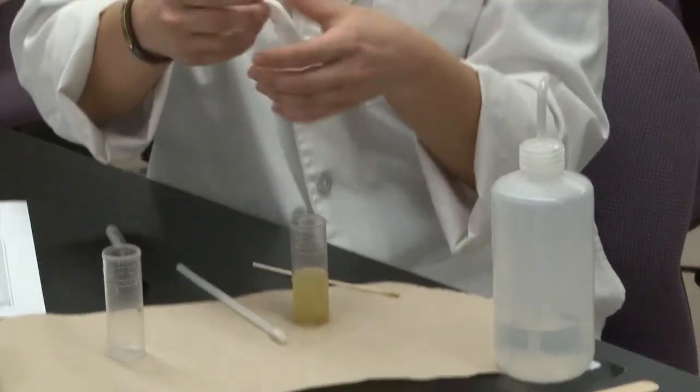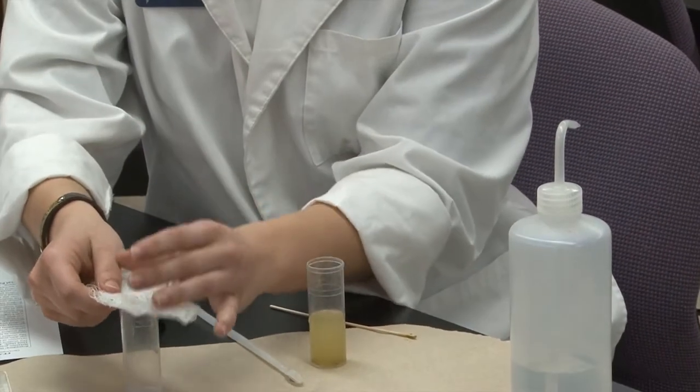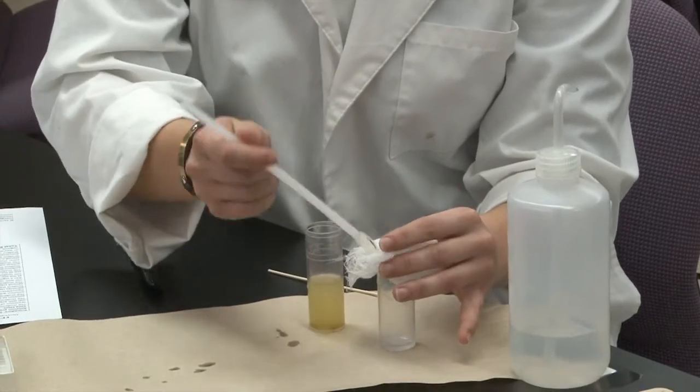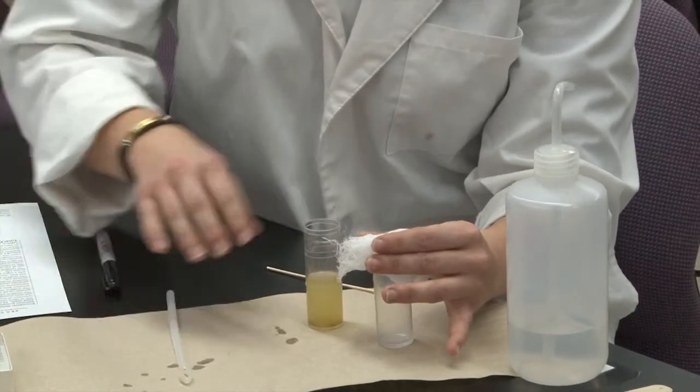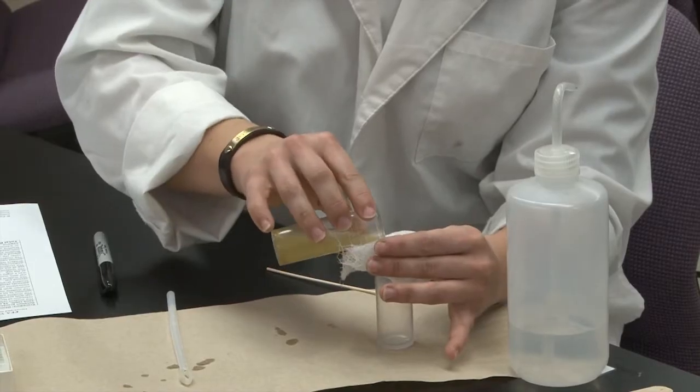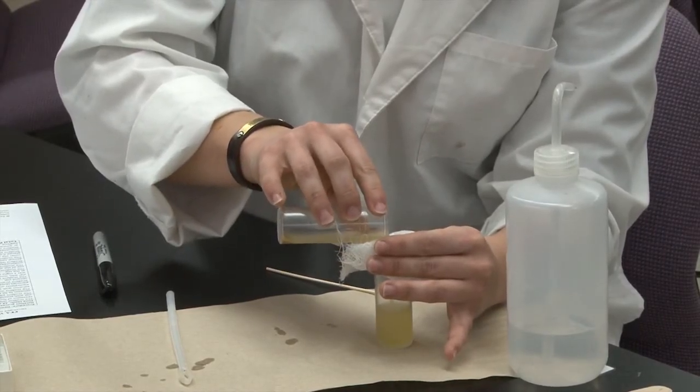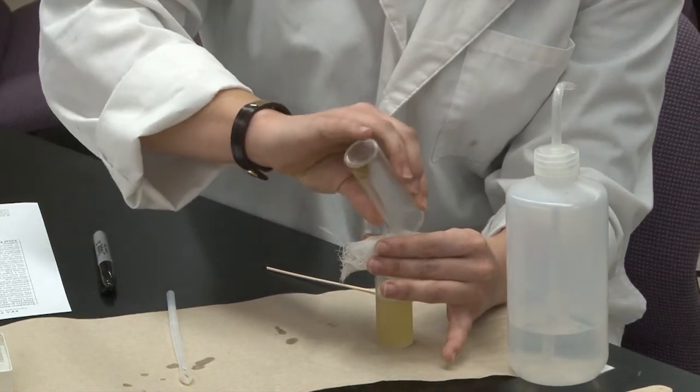Take a plain piece of gauze and put it over a second vial, and drain your sample into the second vial. This will get rid of any of the big clumps that you've got.